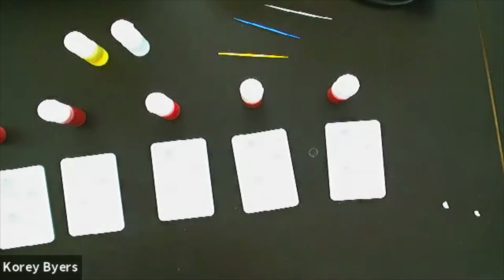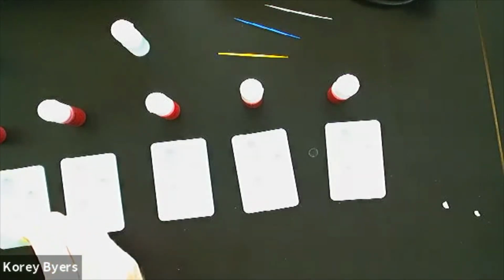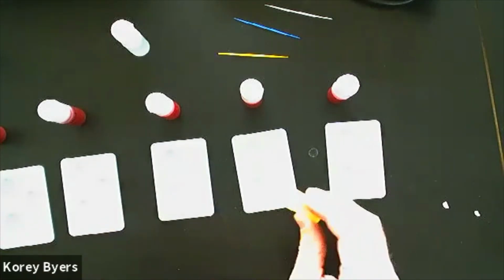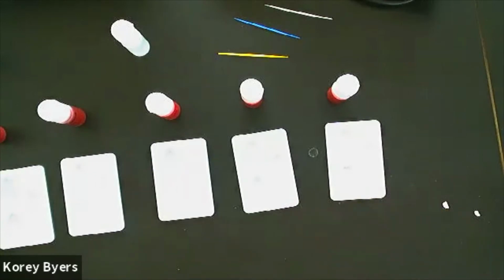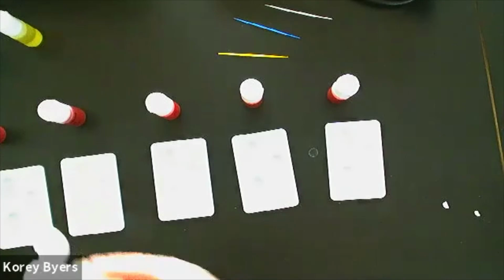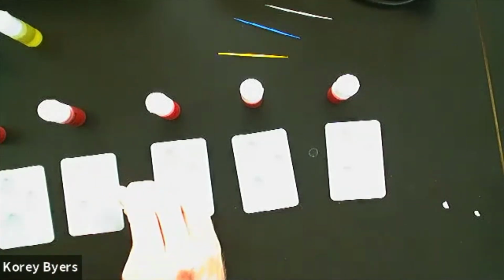Since I have it open, I just go through the row there. Once you do that, take anti-serum B and put a drop in the bottom B well. And then you probably guessed, you'll then take anti-D and put it in the RH well. Just 1 drop, 1 drop.